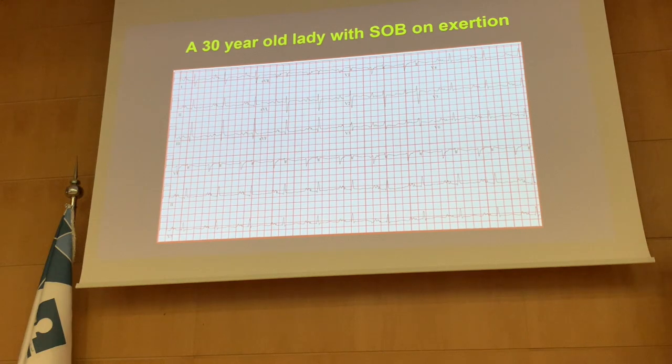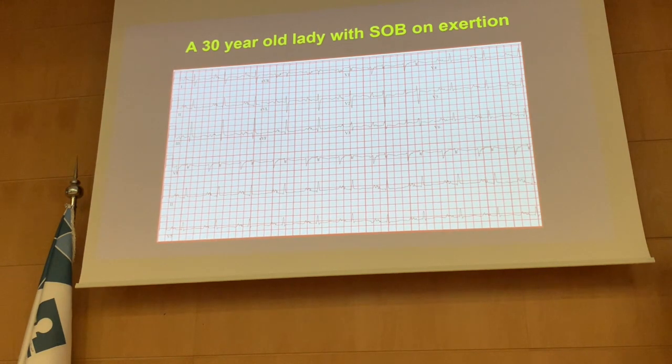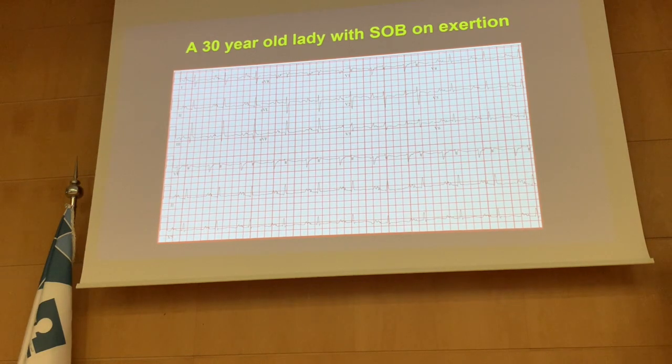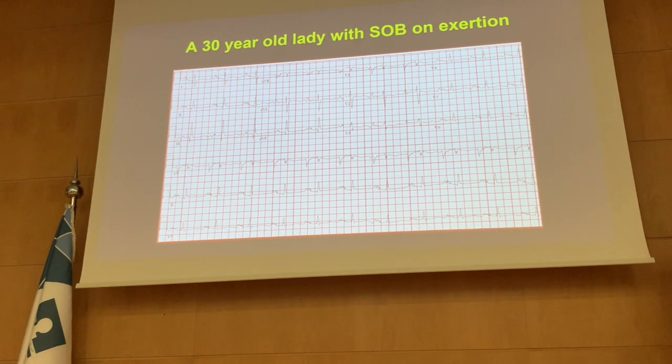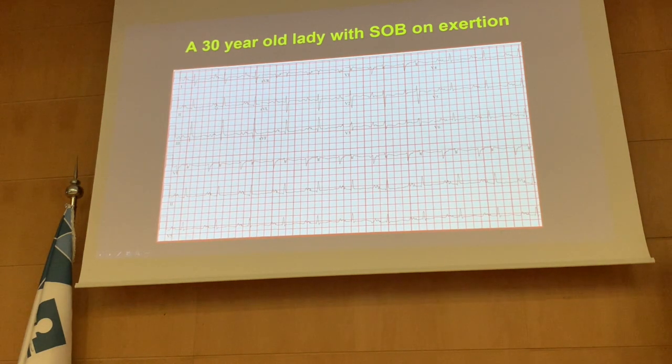And this is also typical in our patient here. She is a 30 years old lady, and remember, pulmonary hypertension is very common in females. It's not a disease of males, okay? And she is coming with progressive shortness of breath. So those patients, before we're going to see chest X-ray, before we're going to read the ECG, we are sure they have ECG abnormality, okay? So what's the ECG finding here?